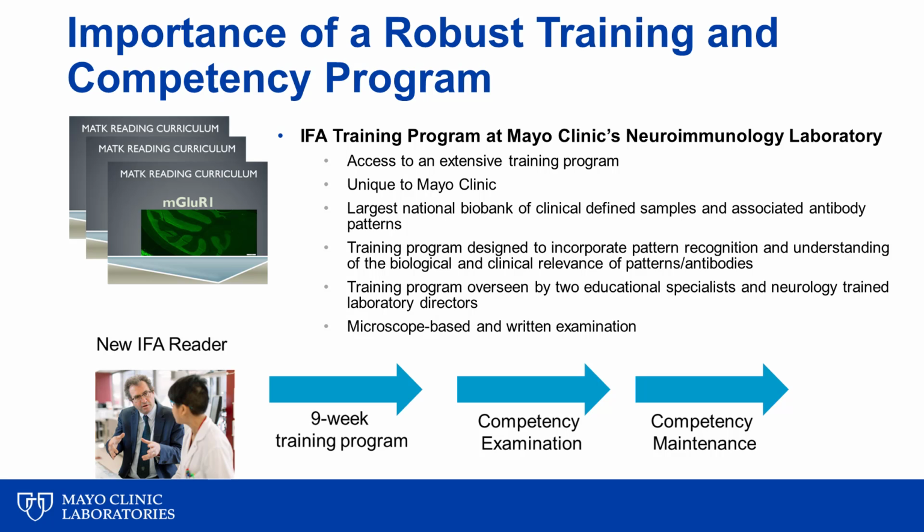The individual will be asked to interpret a complex group of reportable neural antibodies, often in the presence of co-occurring antibodies. If the examination is passed, the staff member then would be allowed to begin interpreting immunofluorescence and cell-based assays on a clinical basis.